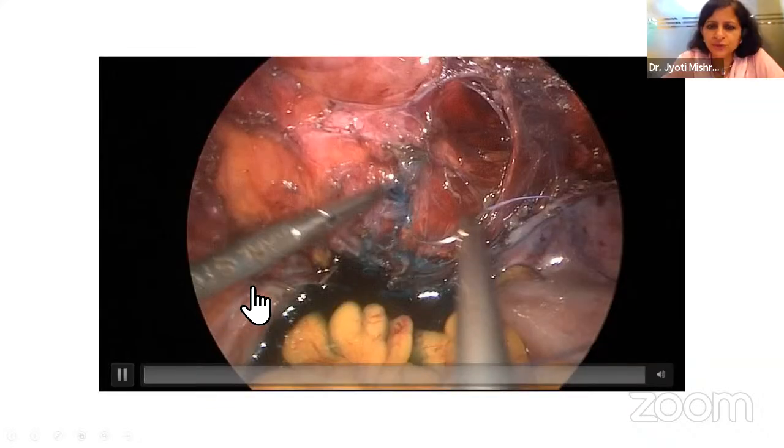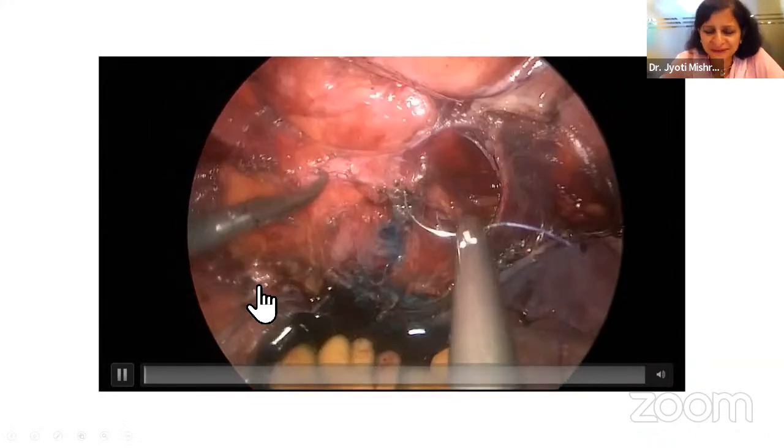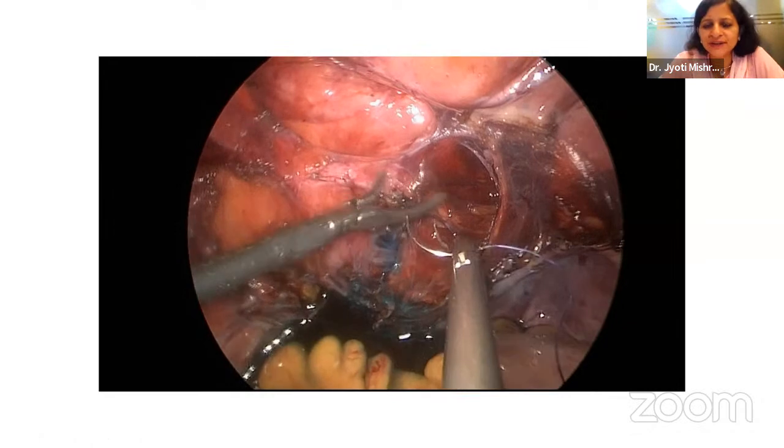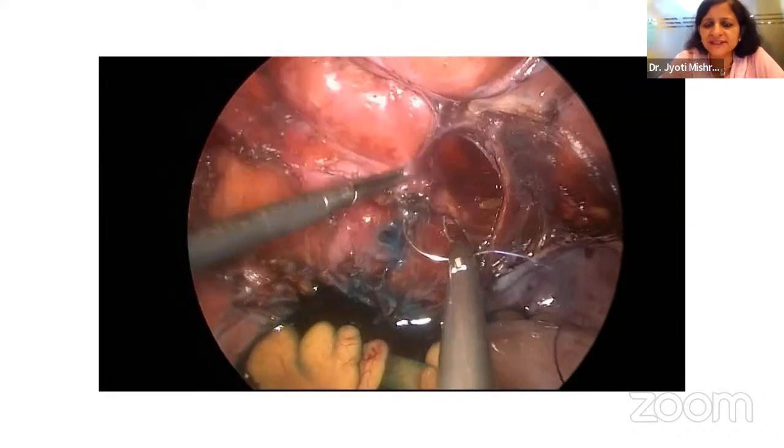Yeah, so we do this routinely now. We have done it after so many cases, and with passing years, you get a lot of complications also. So we are quite comfortable suturing. We feel the bladder is the easiest organ to repair.